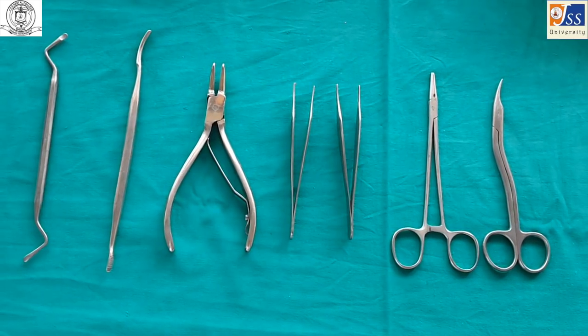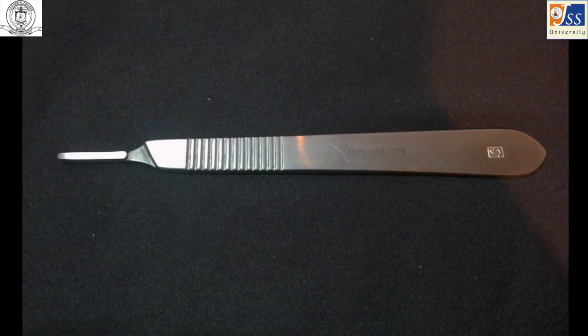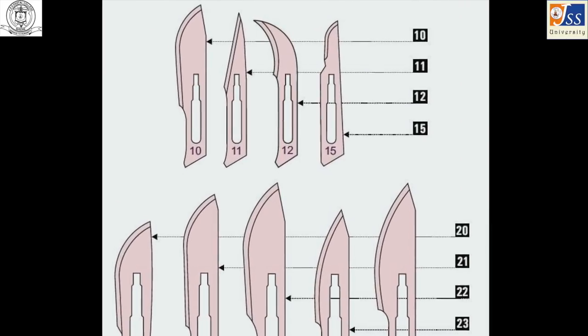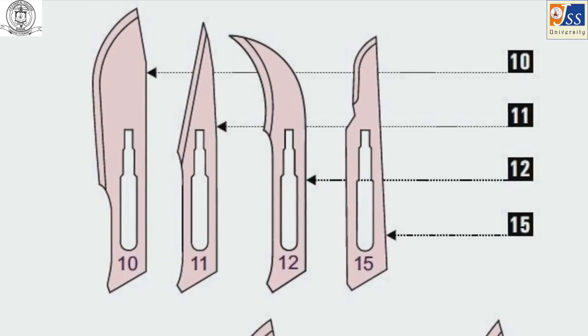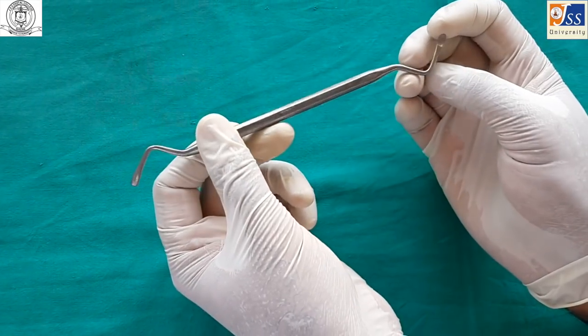After extraction of a tooth, some accessory procedures may be necessary to ensure proper post-operative healing. The Bard-Parker handle and Bard-Parker blade are used for placing incisions; in minor oral surgery, usually number 11, 12, or 15 blades are used. The curette is a double-sided instrument used for removing periapical pathologies such as cysts or granulomas.